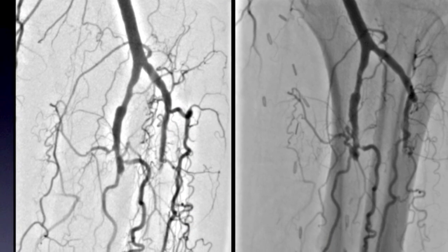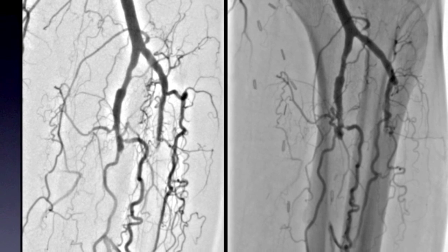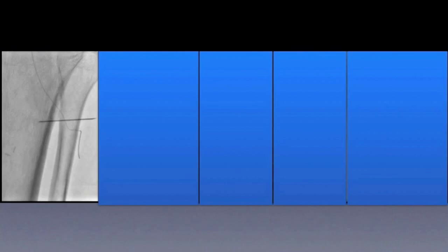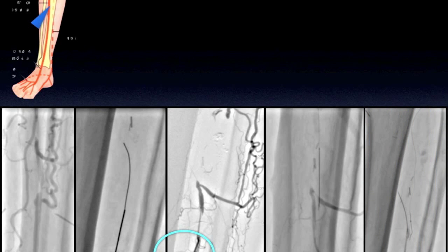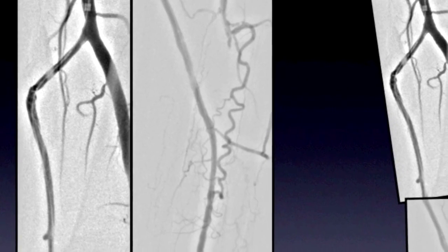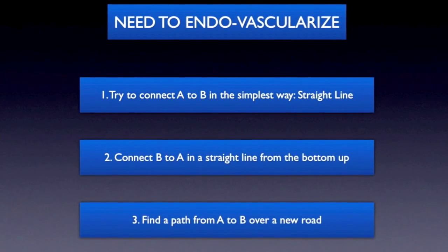Let's look at another situation that's very interesting. This is a case that has great collaterals, and as you can see, there is an adequate peroneal that opens down below through the collaterals. Retrograde allows you to also do techniques from below that don't imply percutaneous punctures. This is a technique where we actually went through the collateral to try to get the artery open. Unfortunately, this gentleman had a prior bypass — a femoral to peroneal bypass — and the wire would constantly go up the old bypass. We decided to do a peroneal retrograde access and eventually angioplastied that bypass in a retrograde fashion. We were very happy to find out that after our retrograde techniques, we got the bypass back open again. Thinking outside of the box — that's what we're trying to do.